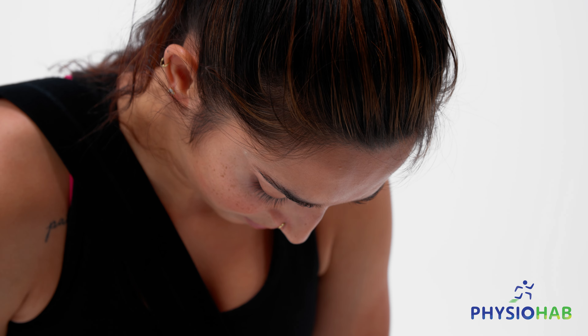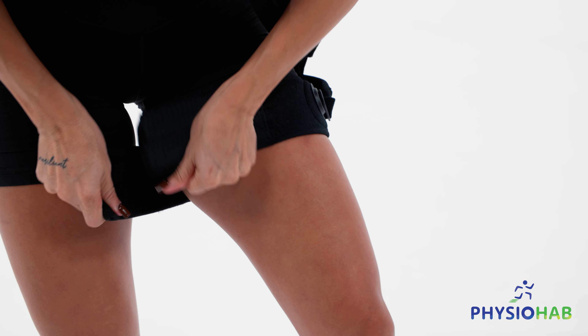Secure the thigh band around your leg as close to the hip area as possible. If you find that the thigh band is too loose, simply fold the band onto itself and re-velcro it for a secure fit.